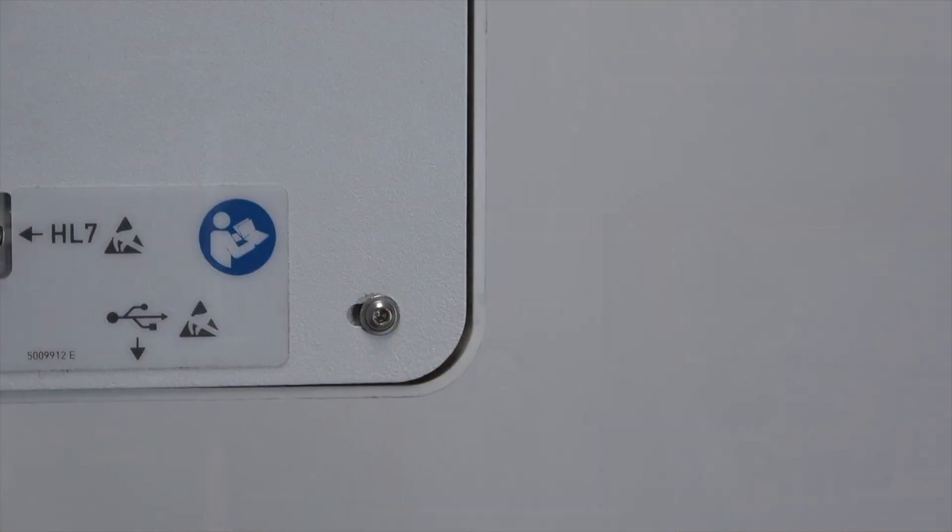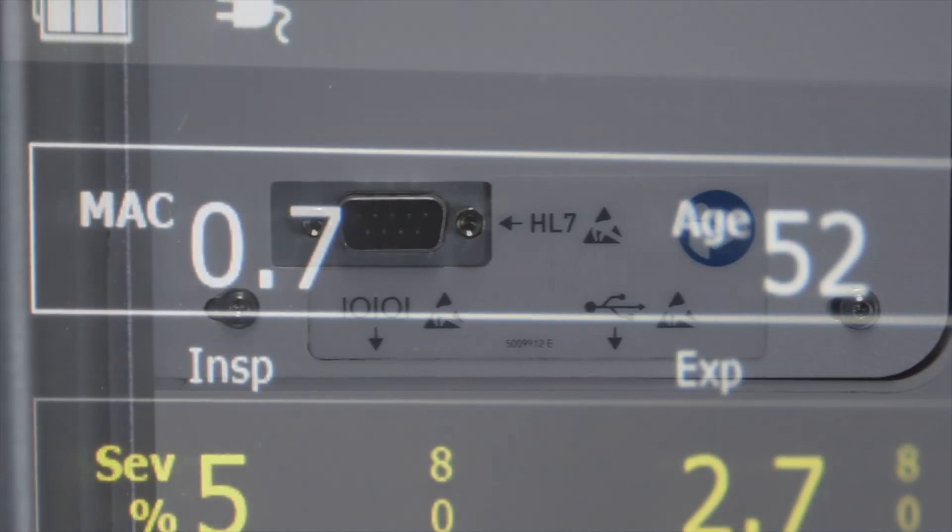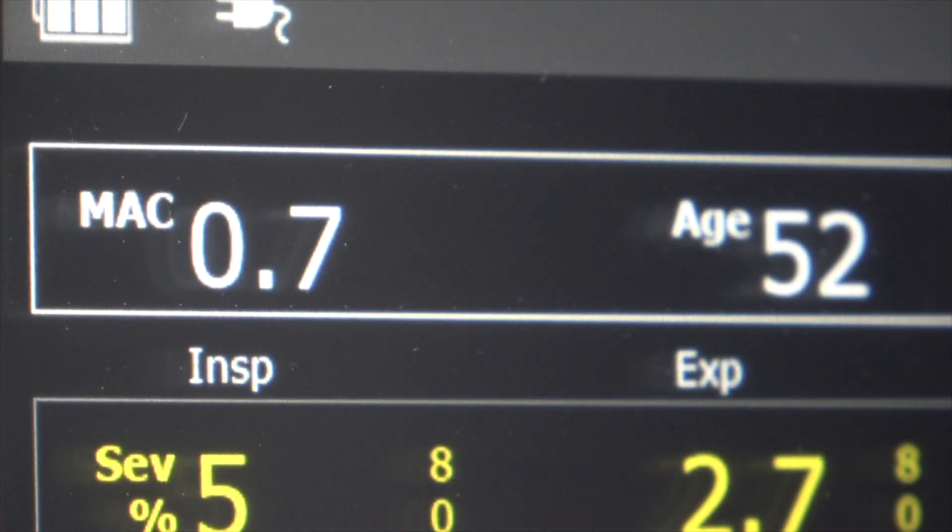The Prima 460 offers HL7 data outputs for connecting to hospital information systems and a Massimo sidestream anaesthetic gas monitoring option.